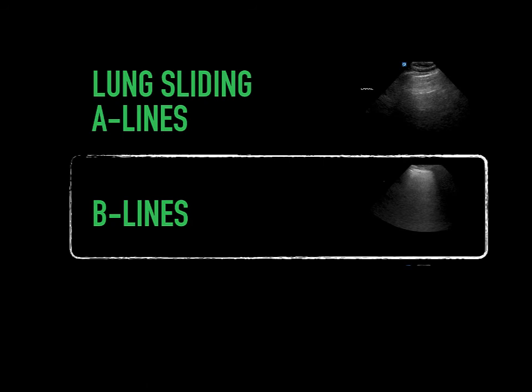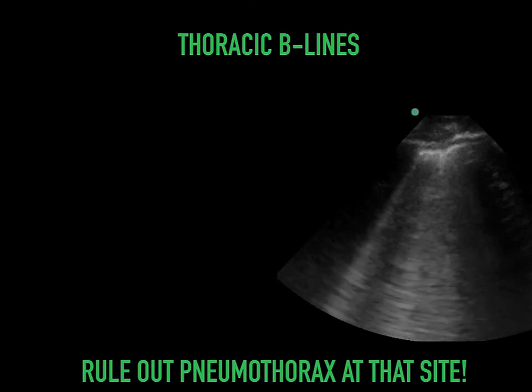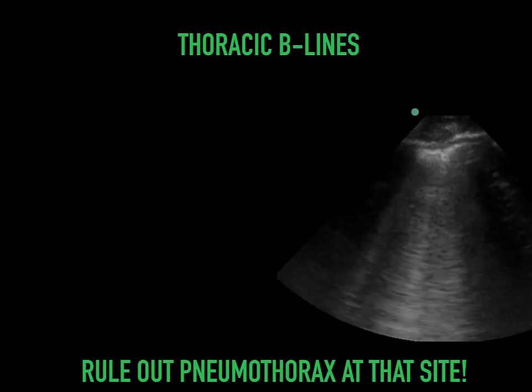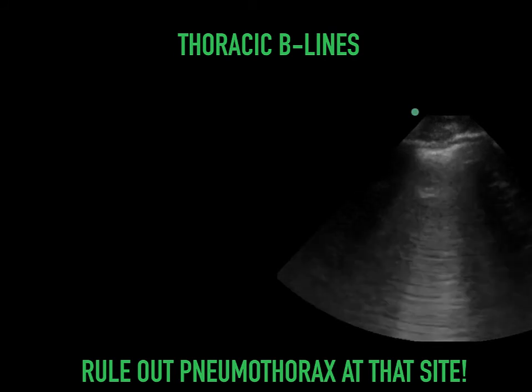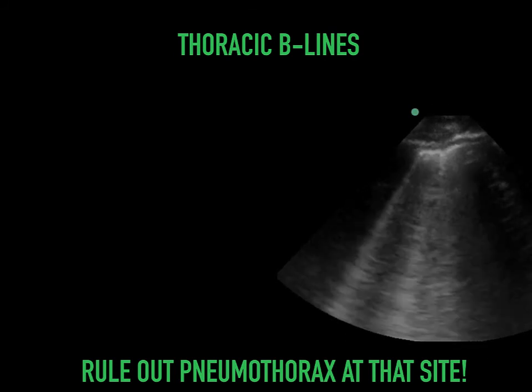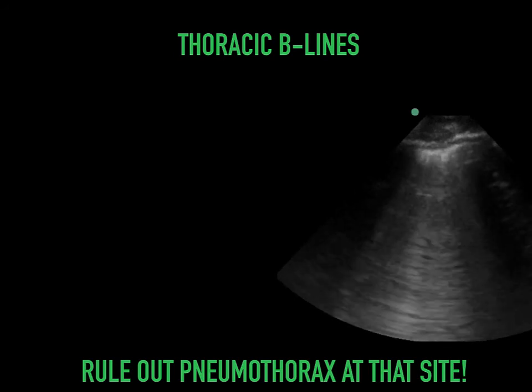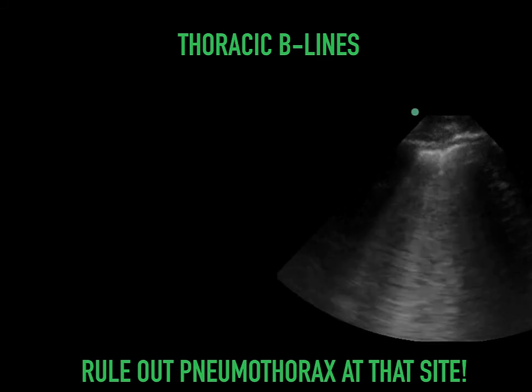Next, moving on to B-lines. We'll discuss these briefly. B-lines rule out pneumothorax at that site. Theoretically, they reflect thickening of the interstitial septae. Even if there is no lung sliding, if you see B-lines, you can safely say there is no pneumothorax. They may, however, have pneumonia, atelectasis, pulmonary edema, or ARDS if you see a lot of them.